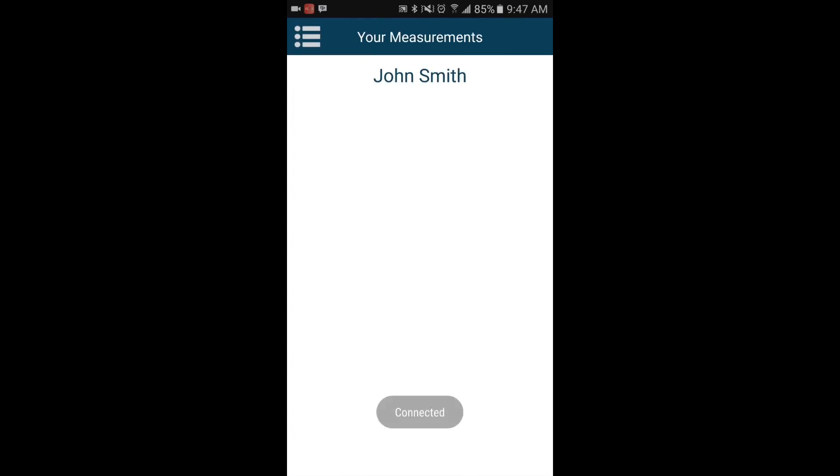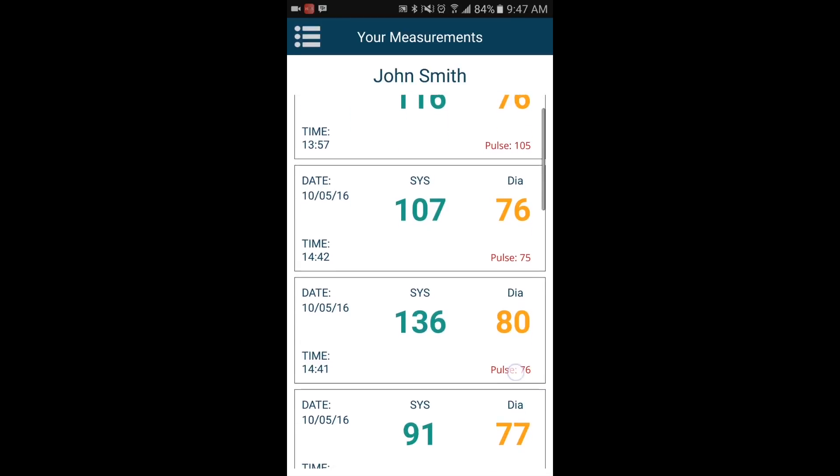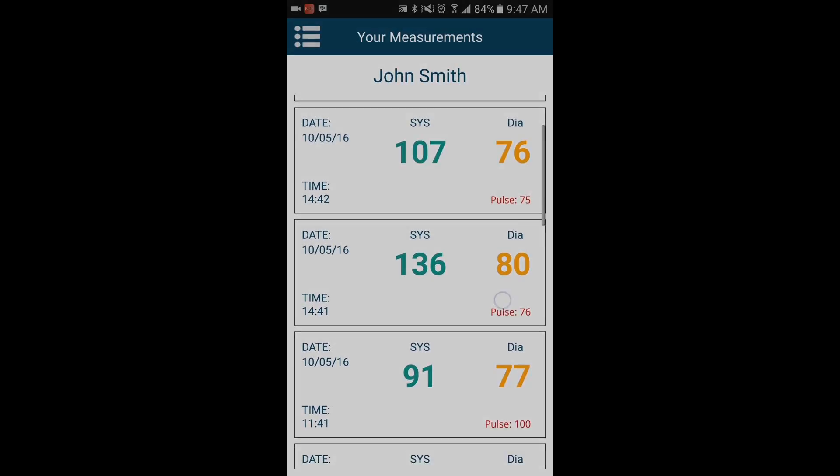A notification will appear on the screen when the monitor is successfully paired with the app. You can only have one blood pressure monitor connected at one time.